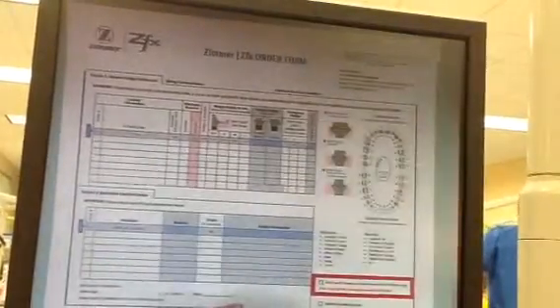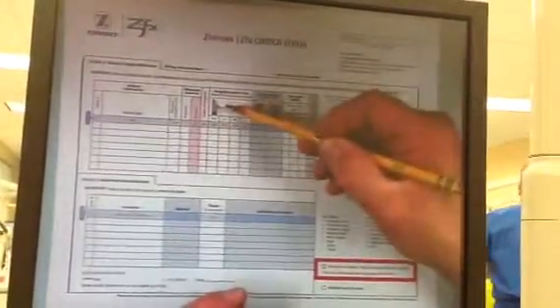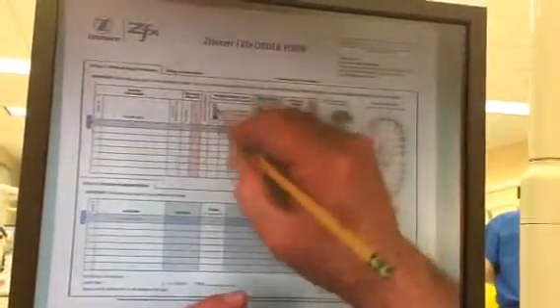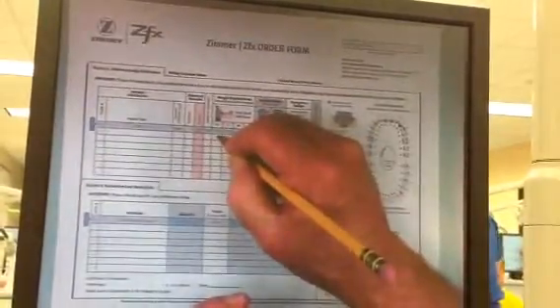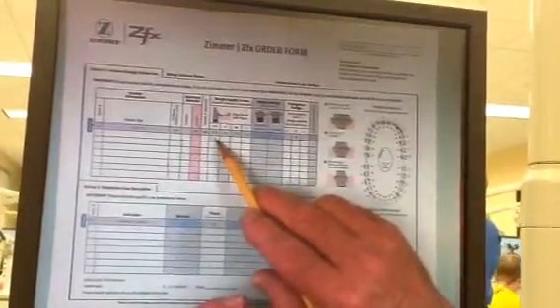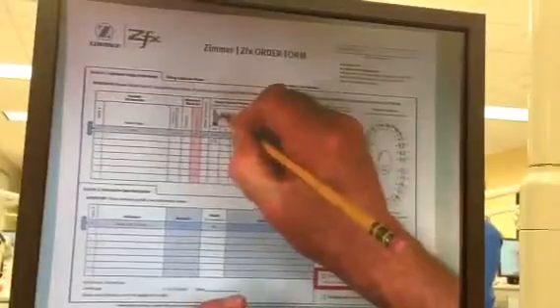And then the other thing you're going to do is you're controlling exactly in the posterior part of the mouth. I might change this to 0.5 because it's not an aesthetic concern, and I want to make sure that I can clean the cement line up, because remember, this is where your cement is.